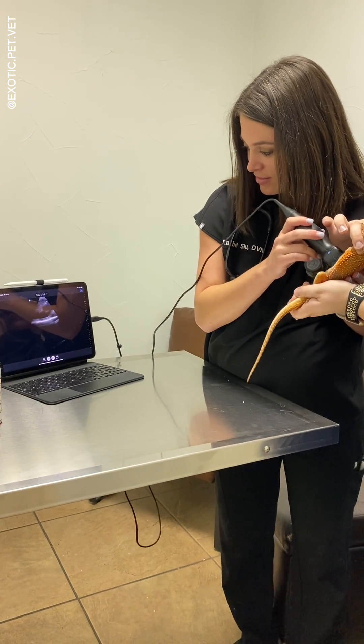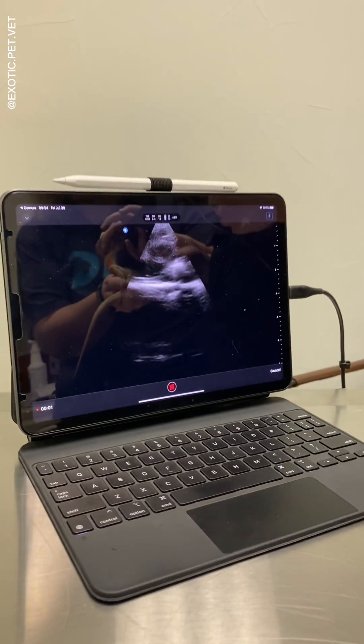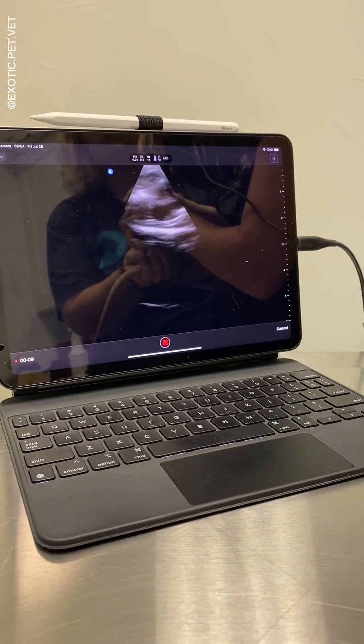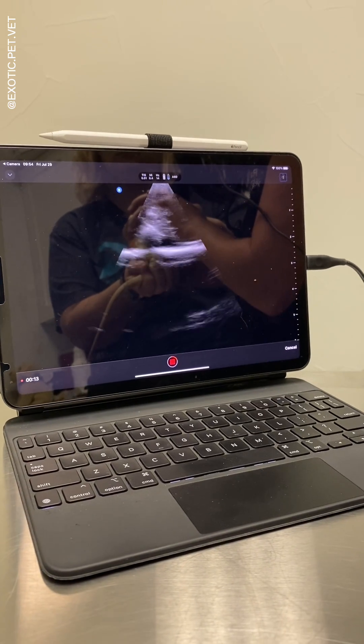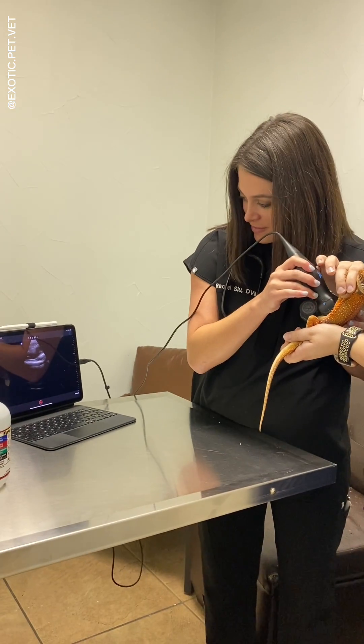However, before diagnosing follicular stasis, it's important to repeat the ultrasound in a few weeks to see if the follicles are getting bigger, smaller, or staying the same. Another reason why I love the Butterfly ultrasound is that you can easily save images to your device so you can reference them again at a later time.